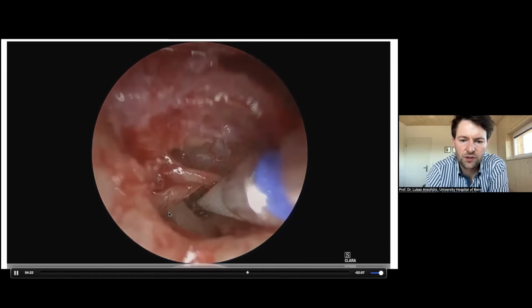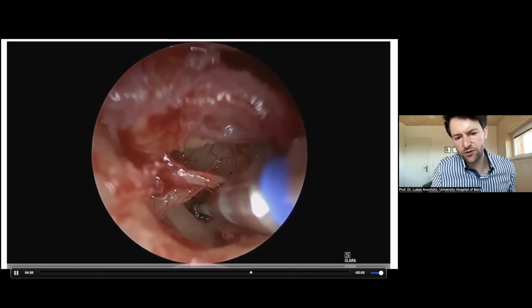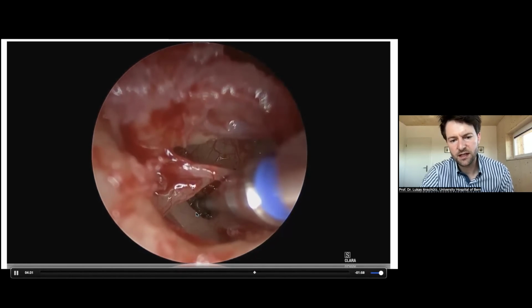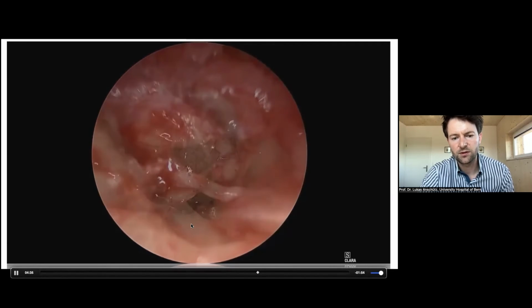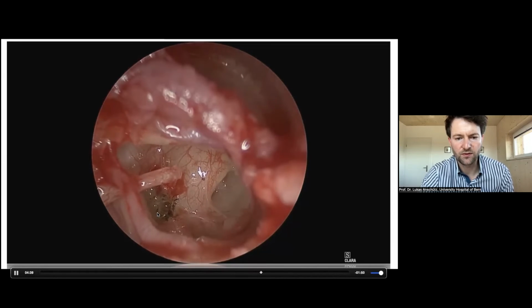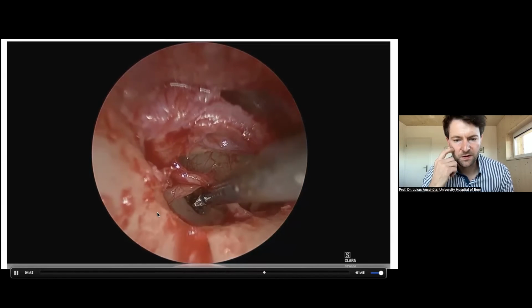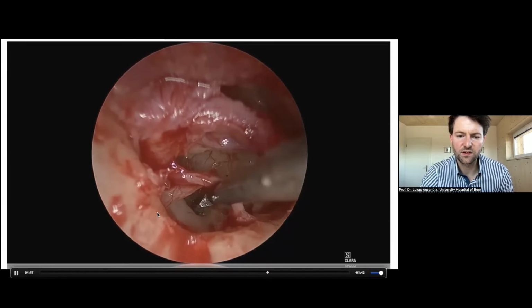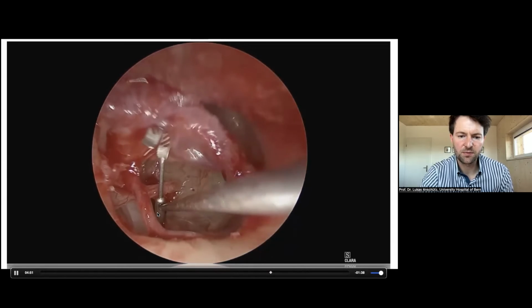And then I use this micro drill. It is a 0.6 millimeter diamond drill, and I can drill a hole inside of the footplate. You can see now it is perforated. You can see the movements of the perilymph. And then I measure the size of the prosthesis, which kind of prosthesis I would like to put inside. And then you can see here the stapes prosthesis.